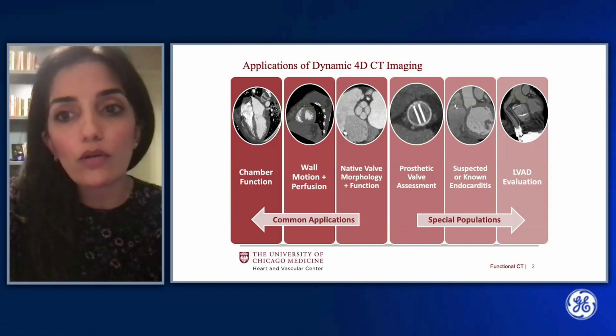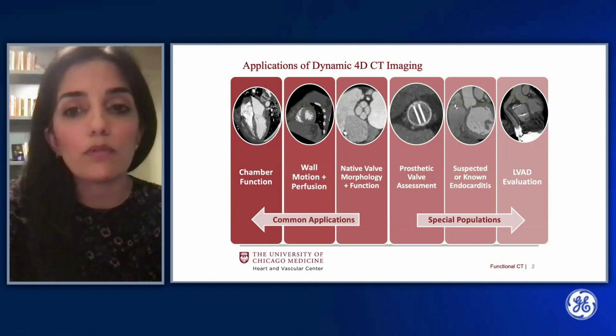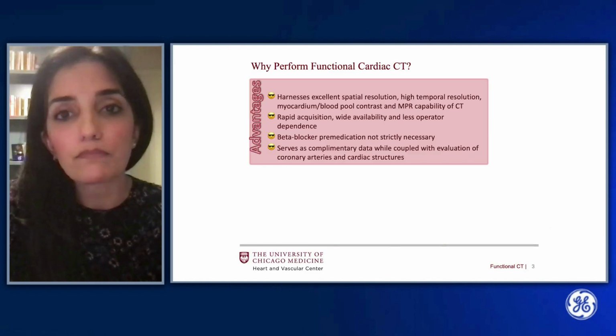Additional momentum is growing in the application of dynamic CT in prosthetic valve assessment, suspected or known endocarditis, and evaluation of LVAD patients, which all represent special populations in which CT can be useful as part of a multimodality algorithm.